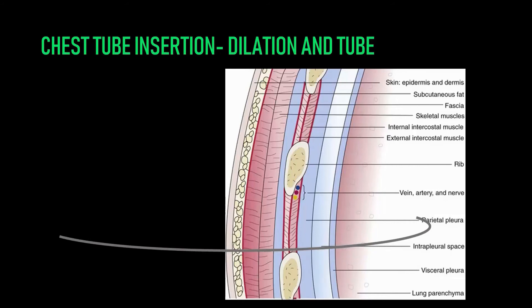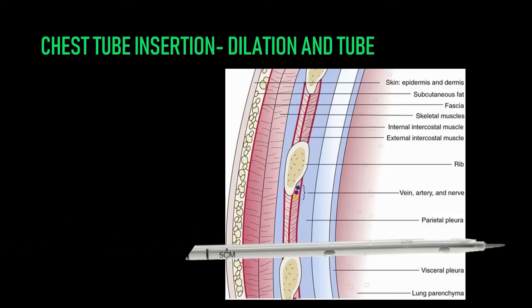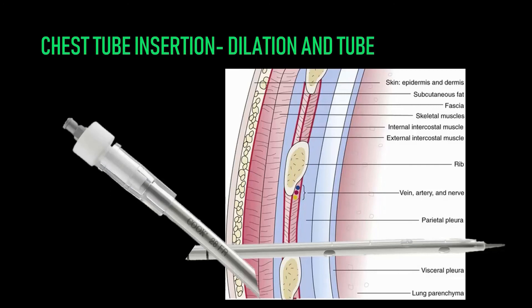Once the tract is dilated, advance the tube into the pleural space, being sure that every single hole on the tube enters the patient's body. You don't have to insert the tube all the way in, but it is crucial that all of the side holes be completely within the pleural space. Advance the tube gently and carefully, and stop if you feel any resistance. You can then withdraw the wire. Note that the Thalquik tube has a plastic inner lumen designed to help the tube slide more easily over the wire and stiffen it as it enters the body. Once you've advanced the tube to a satisfactory depth, take out the plastic inner lumen and the wire all at once, leaving the clear plastic chest tube inside the patient.